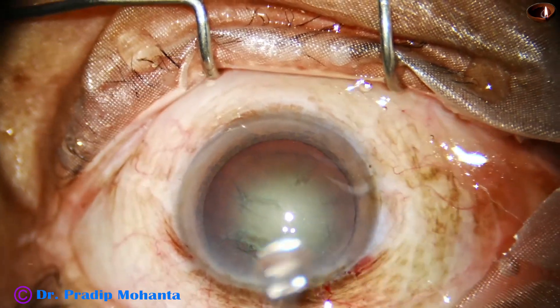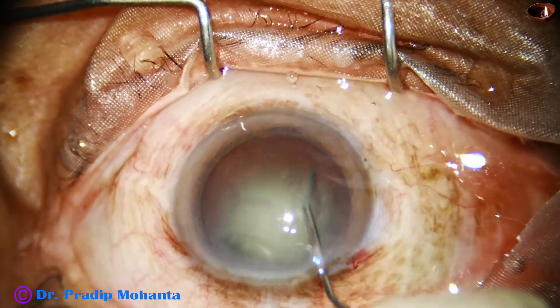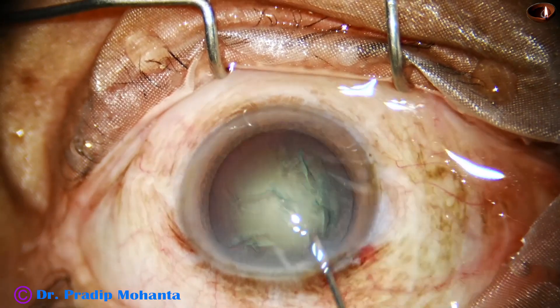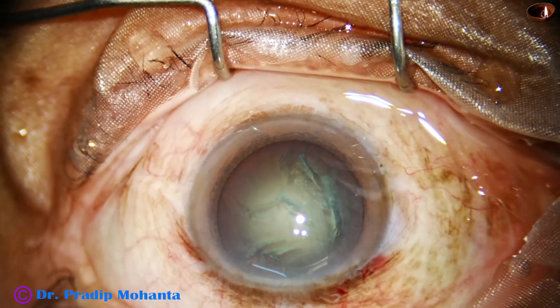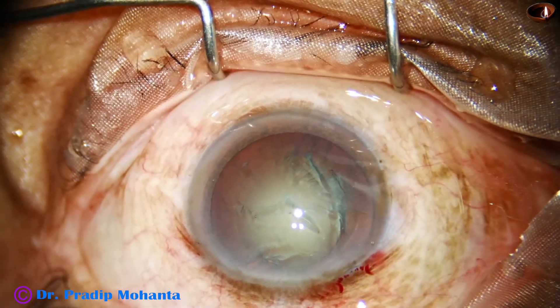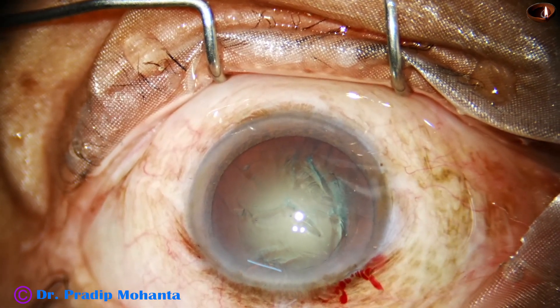Hydrodissection is done. The nucleus is tapped and the nucleus is mobilized. Again, the anterior chamber is filled up with viscoelastic.